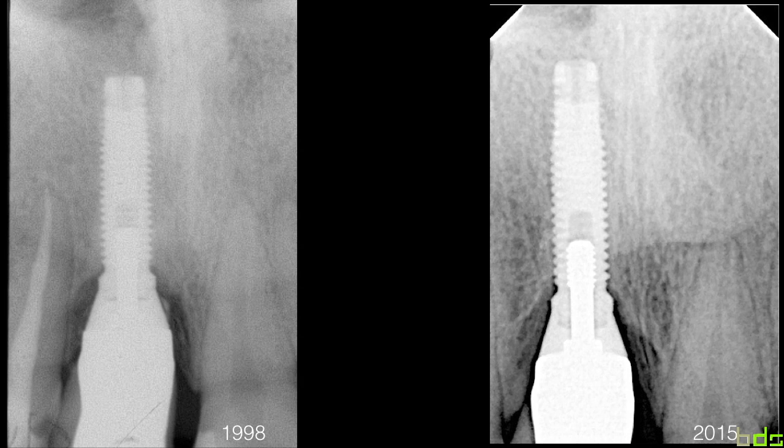Also, one can argue that the papilla is being preserved by the fact that the patient had natural teeth on both sides. But the question we ask ourselves is that if the implant was really that bad as far as the connection and macrogeometry, on the long term, results would have been much worse.